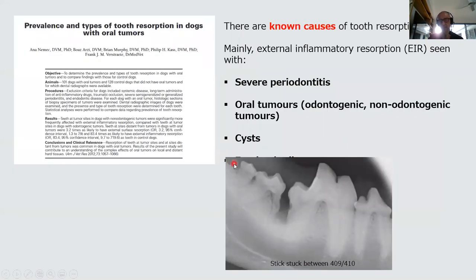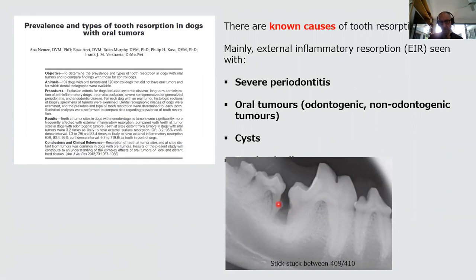There are known causes of tooth resorption, mainly external inflammatory resorption. These include severe periodontitis, oral tumors — odontogenic or non-odontogenic such as fibrosarcoma and squamous cell carcinoma — and cysts. In this radiograph, resorption of tooth 410 and a small resorptive lesion in the root of tooth 409 are visible, caused by a foreign body lodged in the area for several months.